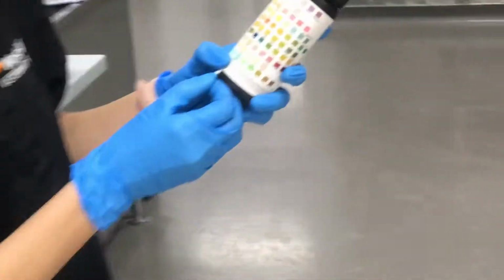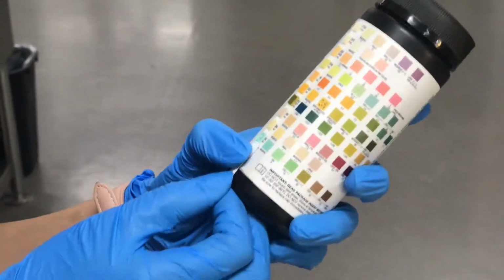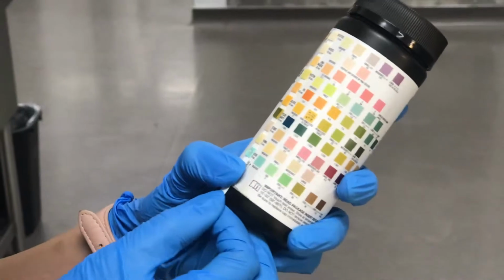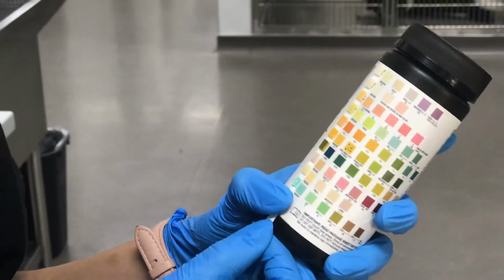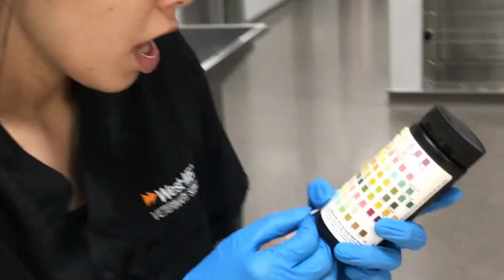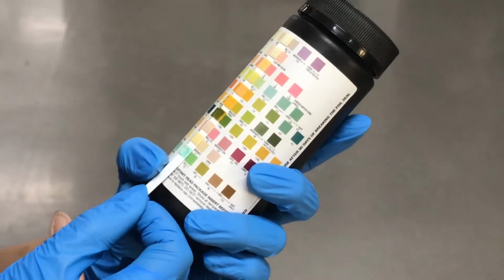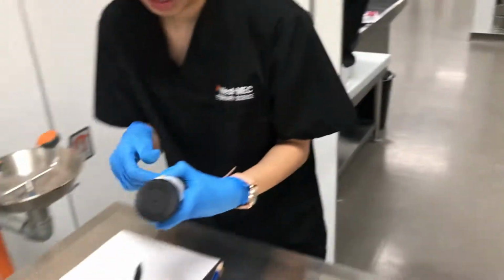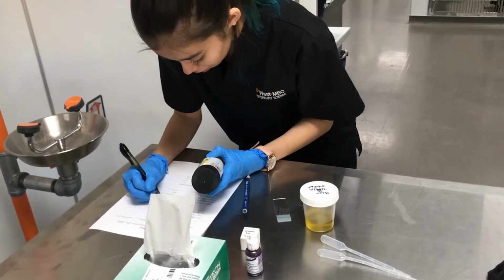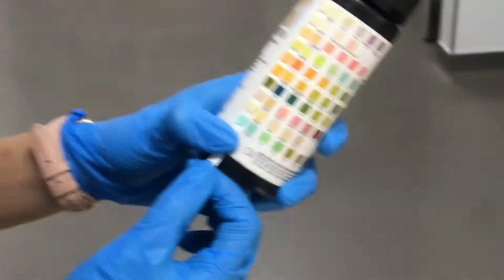This chemical assay strip bottle has specific gravity, but I already read that through the refractometer, so I'll skip that. And I'll go on to blood. After 60 seconds, it reads as negative as well. So the next one is pH, and that one would be around 6.5. For protein, that matches negative.